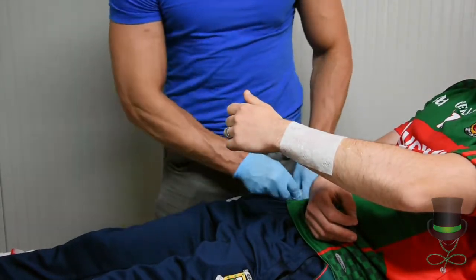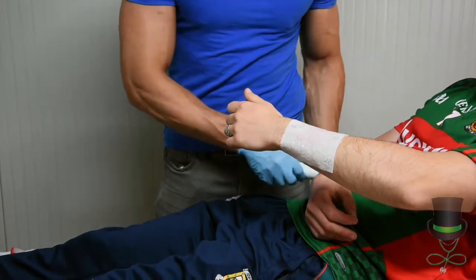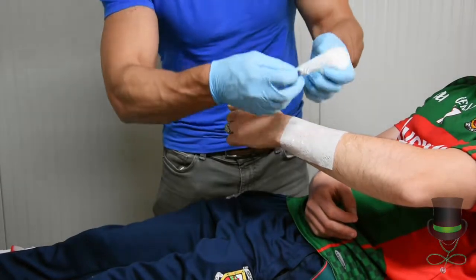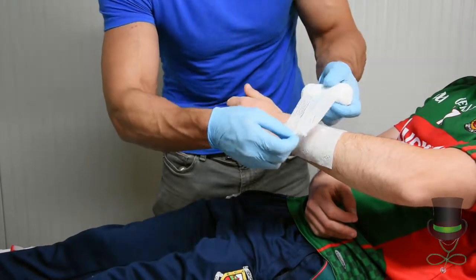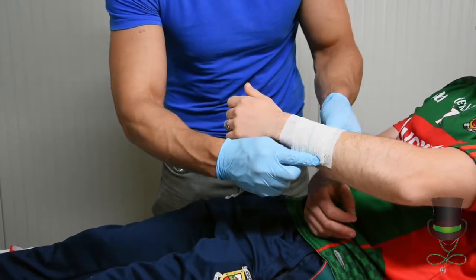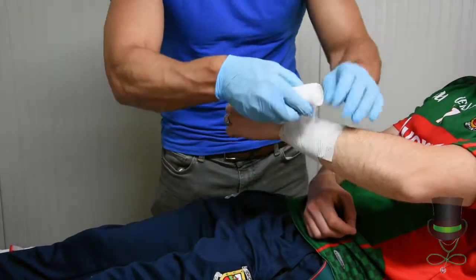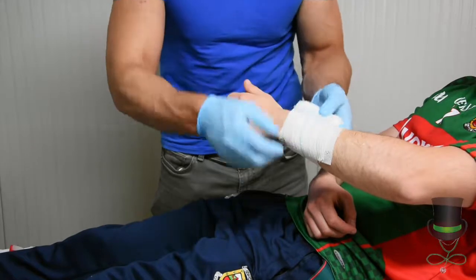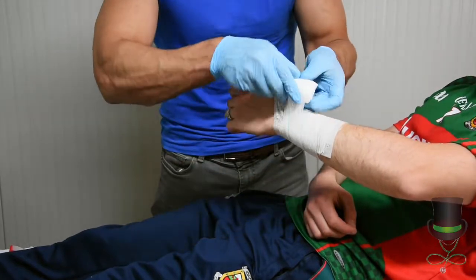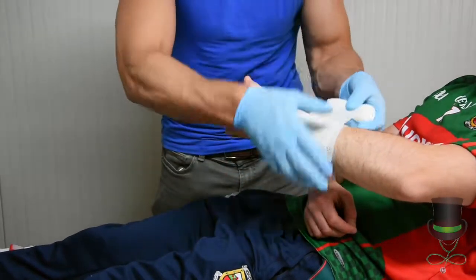Next, open your conforming bandage and use it to secure the burn dressing in place. Try to wrap above and below the site of the wound to prevent further contamination.